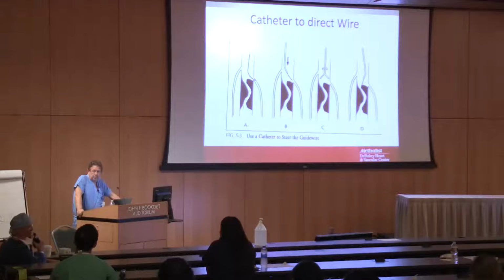You get a sheath that's so tight in the iliac, by the time you pull it out, it takes the artery with you. This happens in radial arteries sometimes when they're doing radial catheterizations of coronaries, and you can avulse the whole shooting match. As long as you've got a wire, you've got a solution. If the wire's been pulled out, then you don't have a solution that you can do endo, because once you've avulsed a vessel, you can't get the wire back across. So your wire is always your safety net.